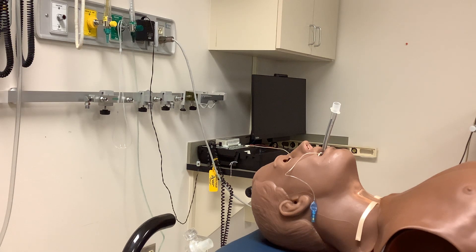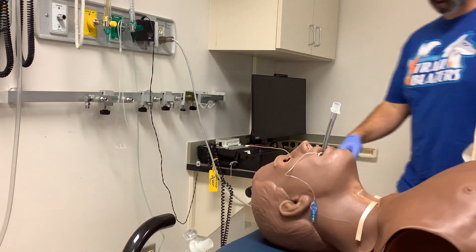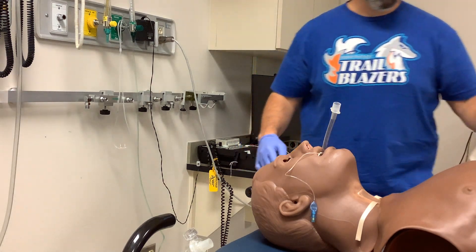In this video we'll discuss securing your endotracheal tube. I'm going to go over a couple of different ways to tape it and then we'll utilize the commercial tube holder as well.